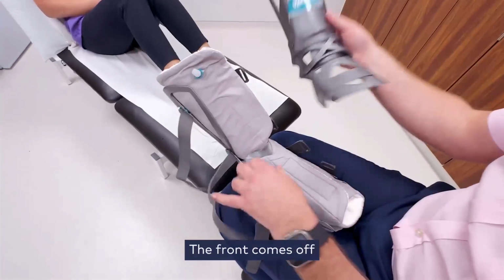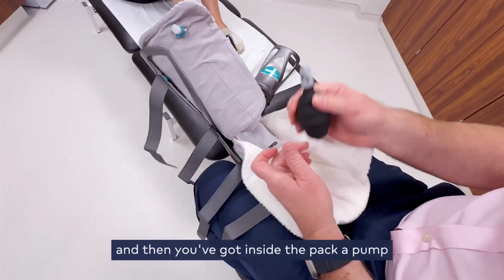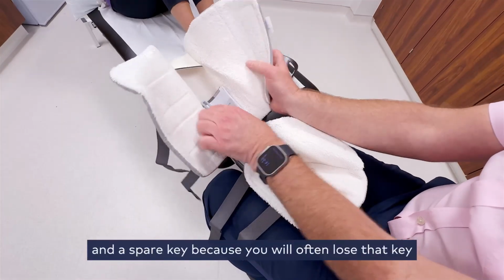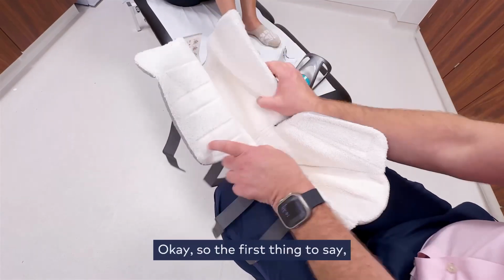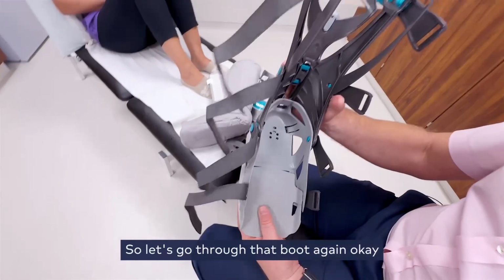The front comes off, and then inside the pack you've got a pump, which is going to be used in a second, and a spare key, because you will often lose that key, and if you lose the key you can't hinge it. So the first thing to say, it's got the guts and it's got the liner. Let's go through that boot again.